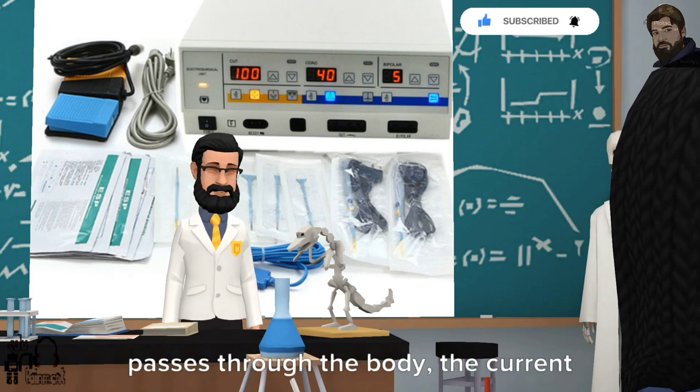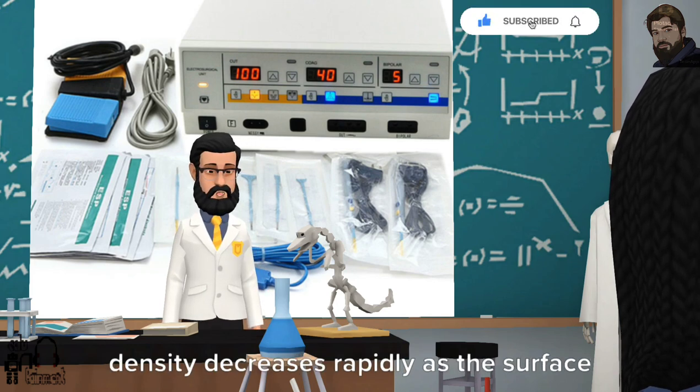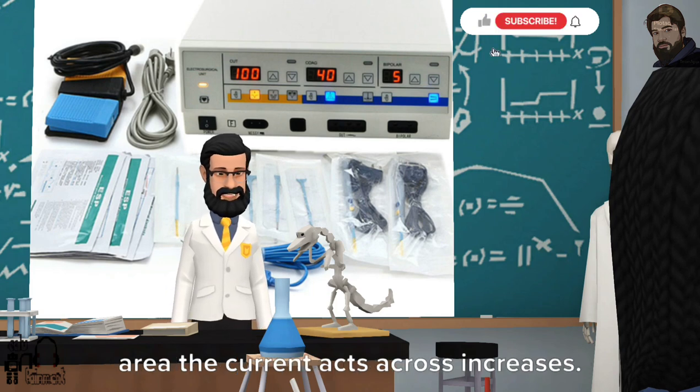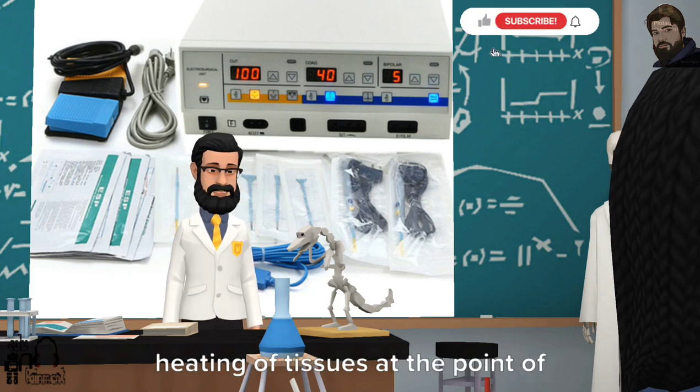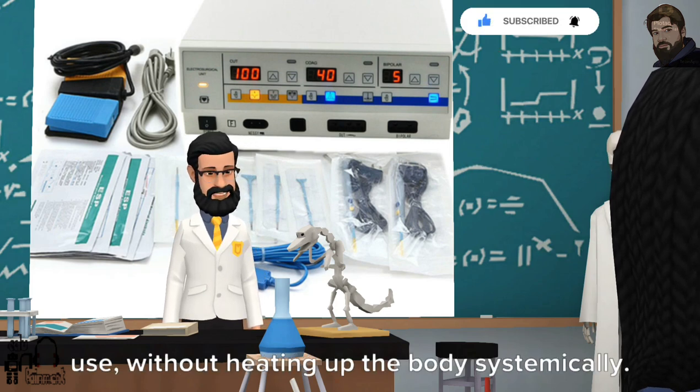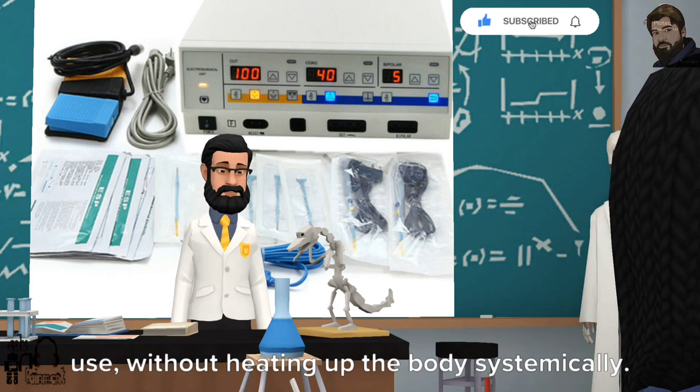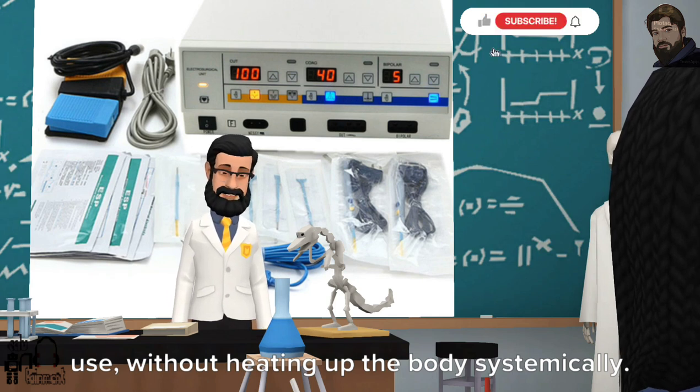In monopolar diathermy, as the current passes through the body, the current density decreases rapidly as the surface area the current acts across increases. Consequently, this allows for focused heating of tissues at the point of use without heating up the body systemically.